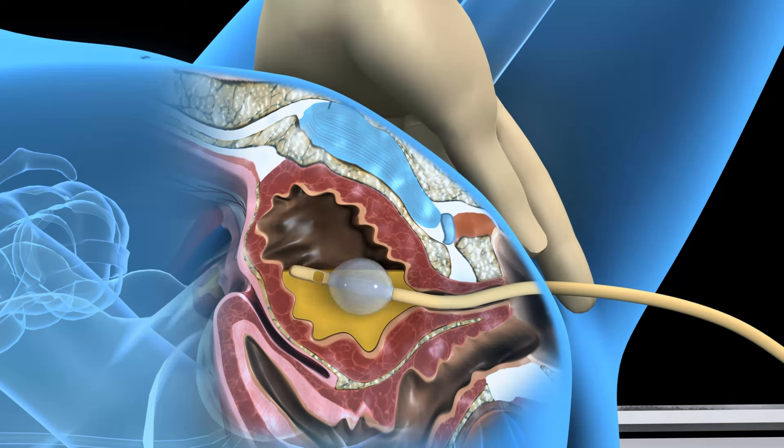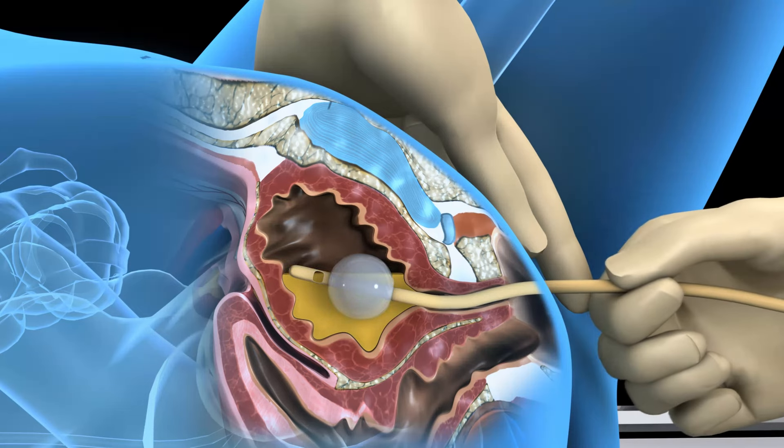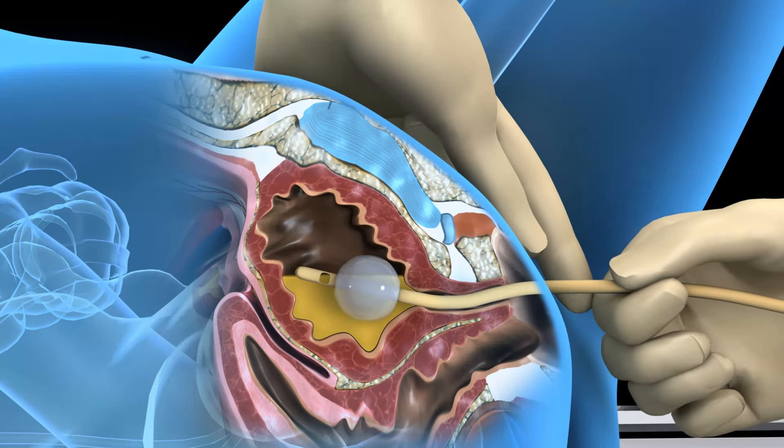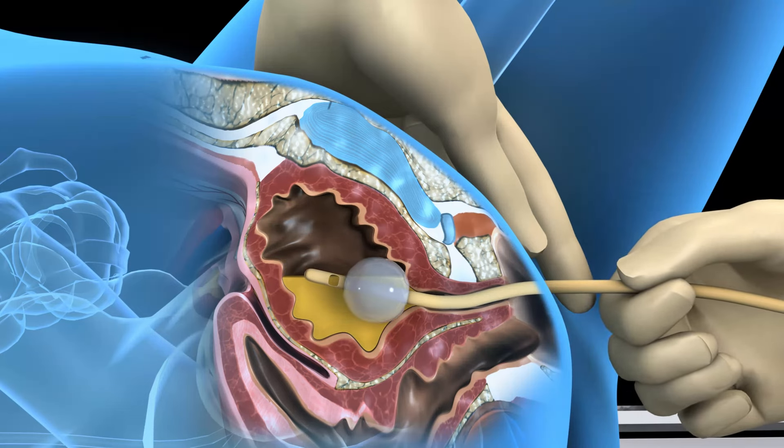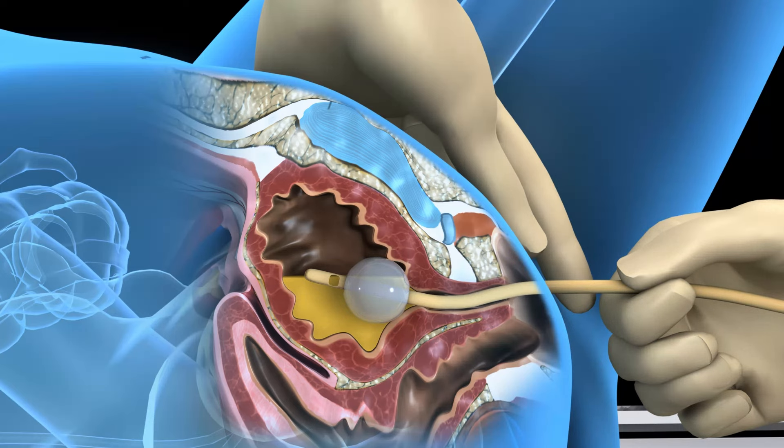Slowly inflate the balloon, and then seat the catheter by pulling back gently until resistance is felt.